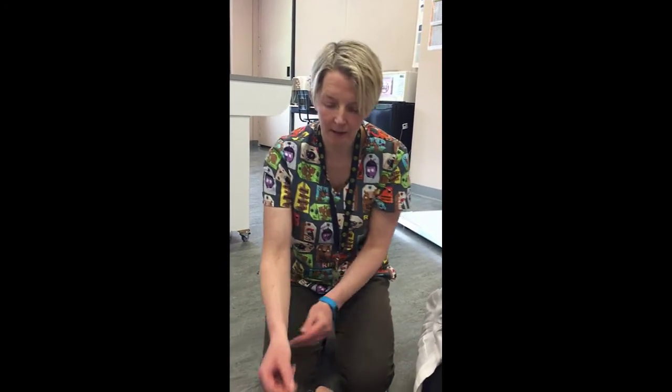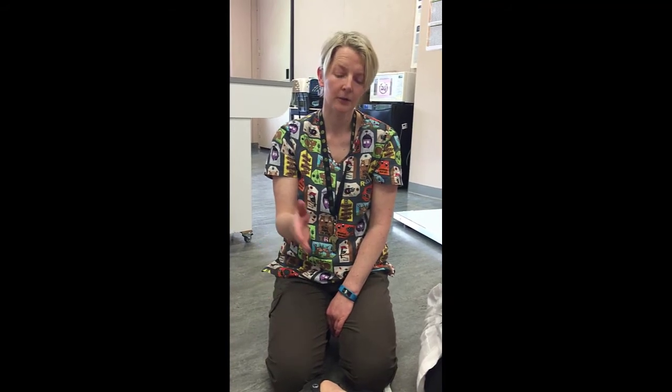And this slide is going to be heat fixed and diff quicked, and we're going to examine this under high power. So if a veterinarian asks you to get a sample for ear cytology, you need to be very clear what kind of thing they're looking for, because if they're looking for ear mites, you need to prepare your sample in a different manner than if you're looking for bacteria and yeast and cells. And it may be that they want you to do both, in which case you might need to prepare your samples in both ways.